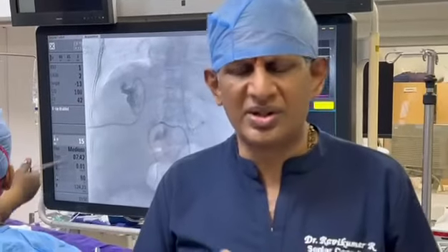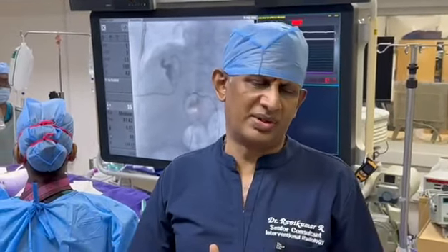Before going to the procedure, certain key steps that every intervention radiologist should be looking at, and especially it will be very useful for the intervention radiologist in training and for the fellows. Whenever you see obstructive jaundice, we all tend to jump into the procedure, but I would say look into the following points.